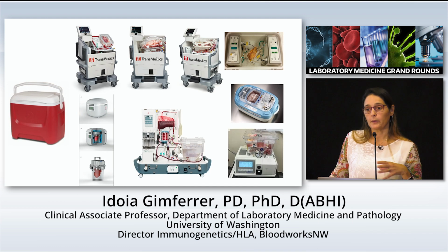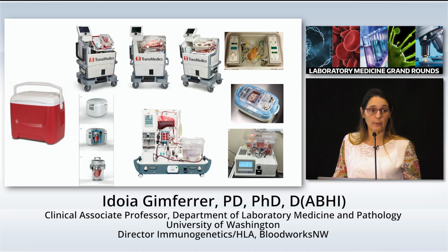We are moving to these technologies. Our OPO uses Transmedics, and they ship the organs. When they need to ship the organs far away, they use this system. As you can see, it's much more expensive. But now a kidney can last 3 days. It's not 24 hours. You can ship them far away.